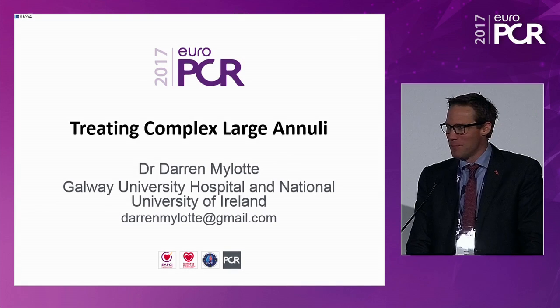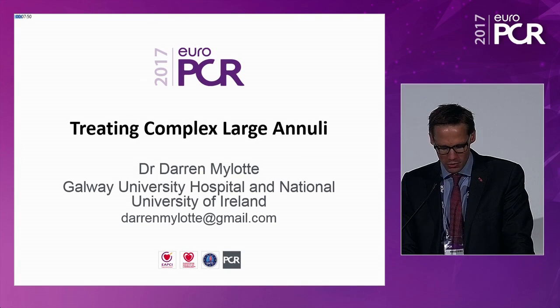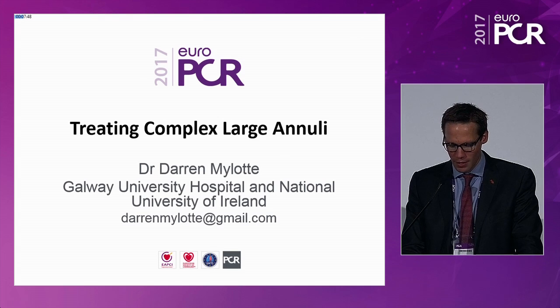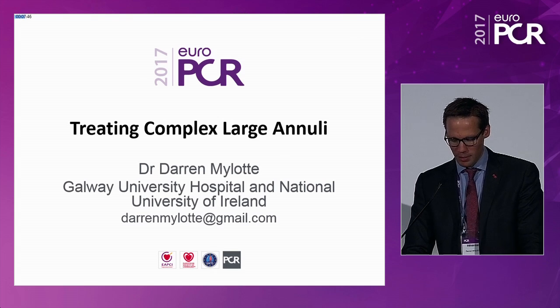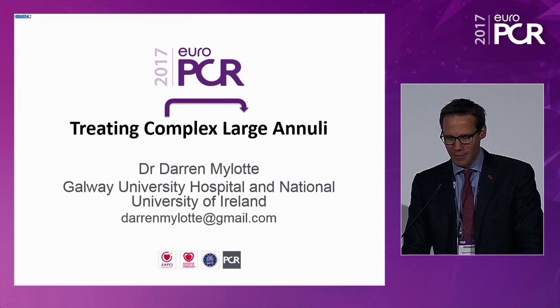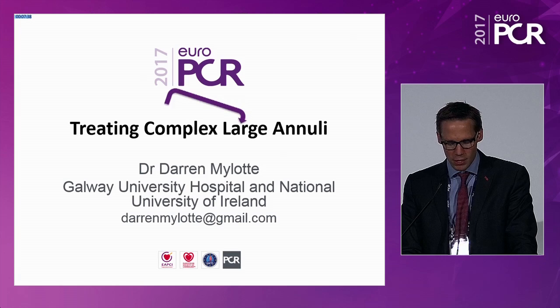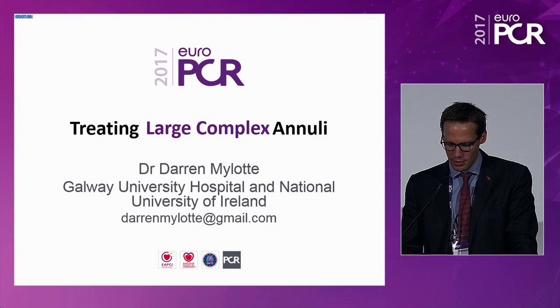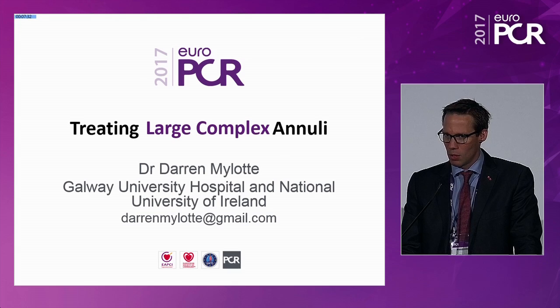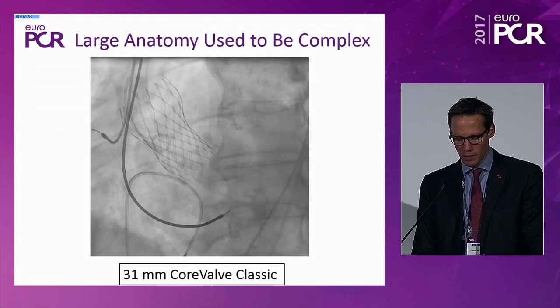So, dear chairpersons, thank you for the invite to speak on treating complex and large annuli. When I thought about this a little bit, I realized that maybe we could turn these two words around, because until recently, for me certainly, as an Evolut R user, pretty much all large annuli were complex, and that has changed recently in my practice.